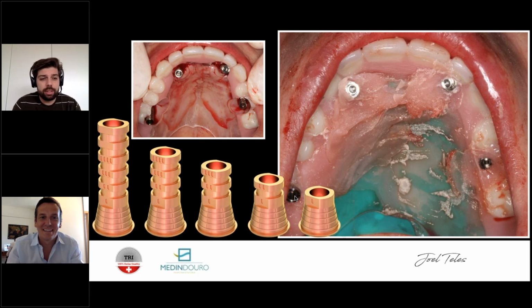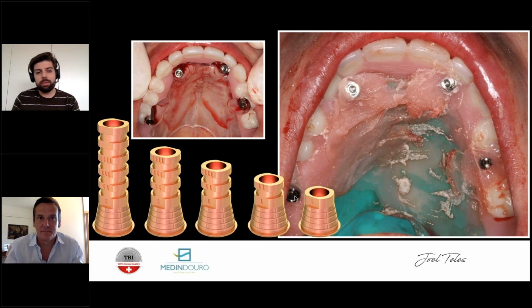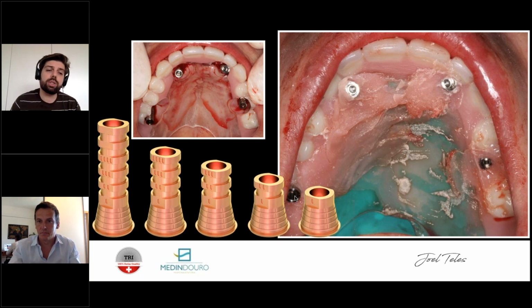Yes. Before we go into the immediate prosthetic creation, because it's one topic itself, there was the question of Nessie Ayrton: why do we cut a lot of bone, which is a part, I think, of the all-on-4 technique, and maybe you can just quickly answer, because the time is running. Yeah, I don't like to cut bone. Nobody likes to cut bone. It's only about those things that I just explained. You need to think prosthetically. So if the restoration tells you that you need to cut bone, you have to.